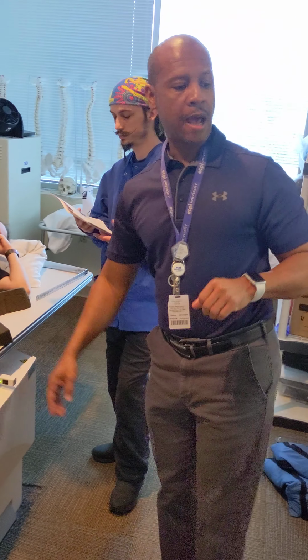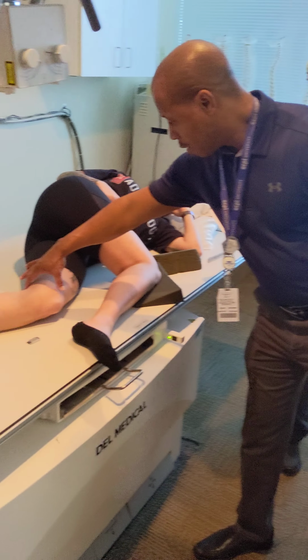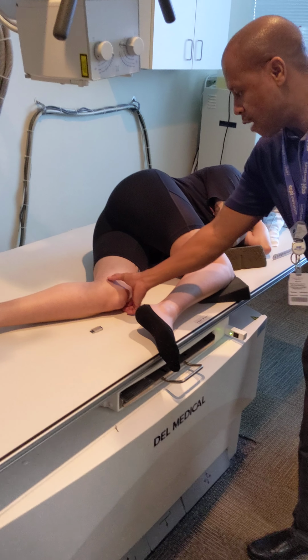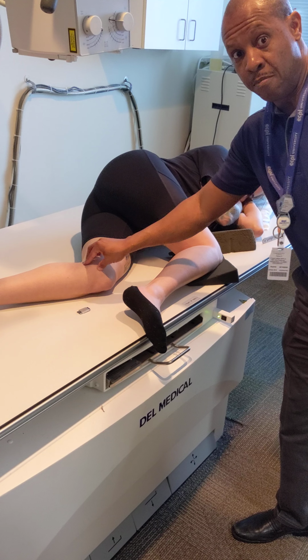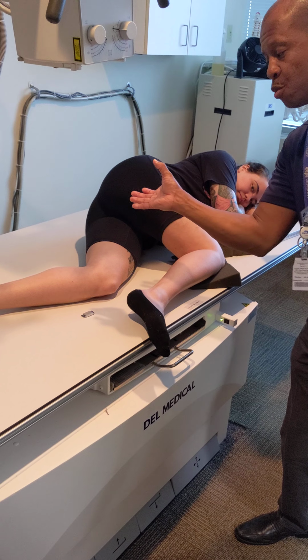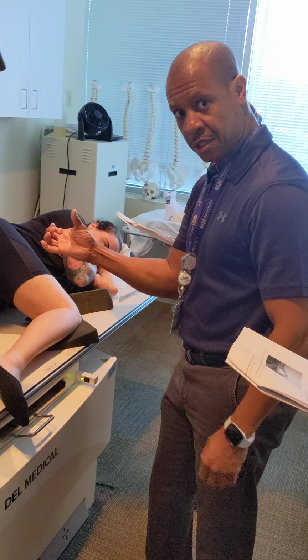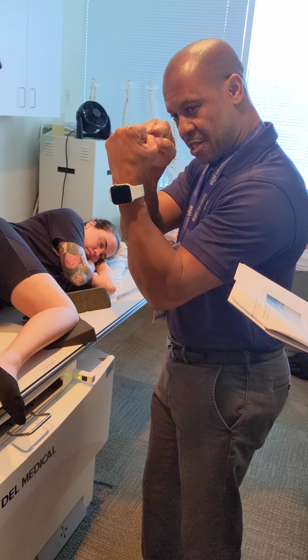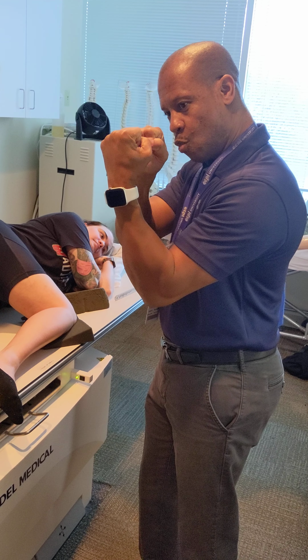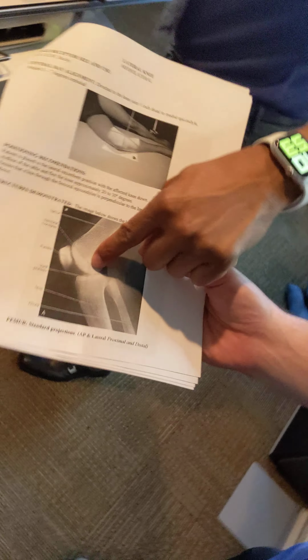Now, one of the problems with the lateral knee, the picture y'all have is a very nice picture here, but Ari, roll down some. All right, if I roll her leg like this, I have now taken the condyle on the medial side and moved it forward. And the one on the other side, I've moved it back. We call that rotation, over and under rotation. Normally they should sit side by side, you can't see both, but if you do like this, now you can see one and the other. That's not a good thing. You want them to be superimposed, how they are in that picture, because they're overlapping each other.